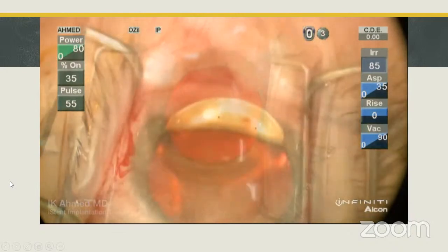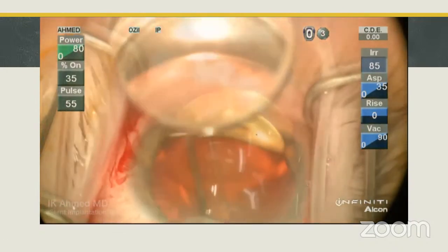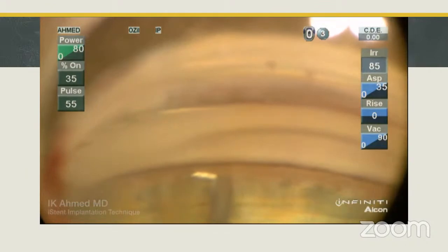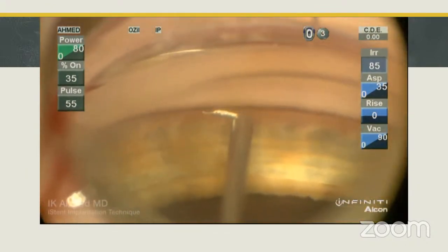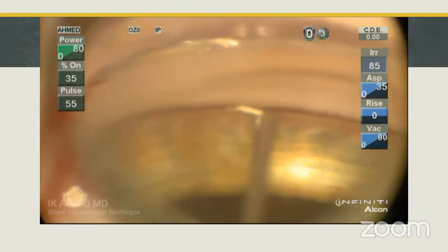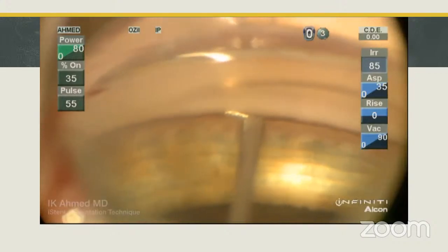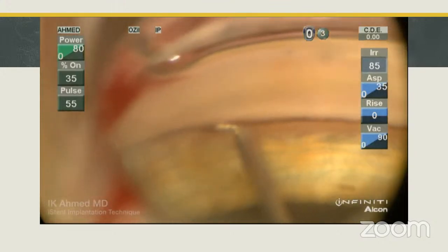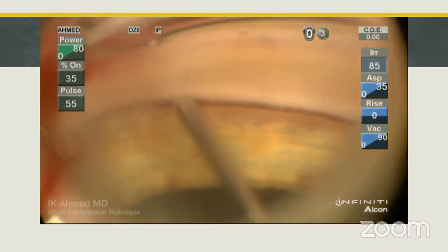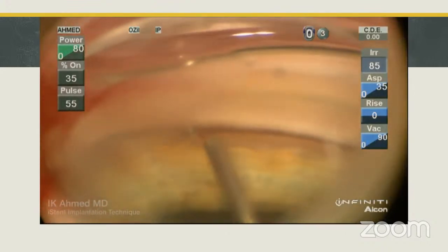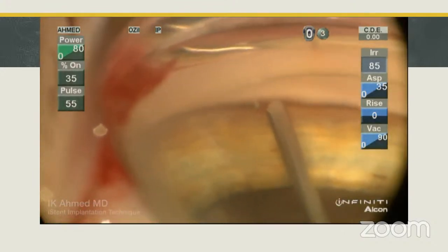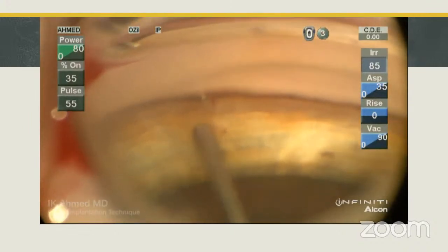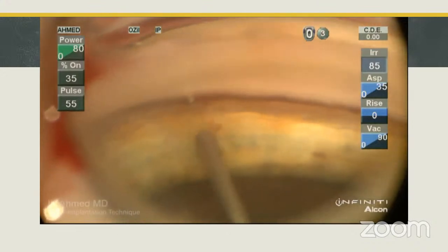In this video, the eye stent is being implanted prior to phacoemulsification. The head is turned, the microscope tilted, and a Swan-Jacob lens is used to visualize the nasal angle. We enter the trabecular meshwork at a 30-degree angle, with the self-trephinating tip approaching the inner wall. This allows adequate entrance into the canal, avoiding entrapment within the inner wall. Once a third of the device is in the canal, the hand is lifted and straightened to allow smooth passage. The snorkel end is then released gently and the implant is tapped against the canal wall to ensure adequate placement.